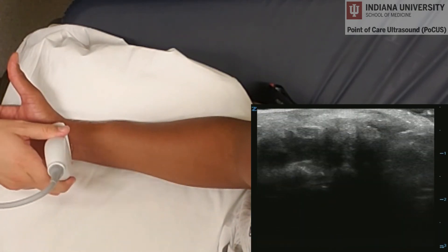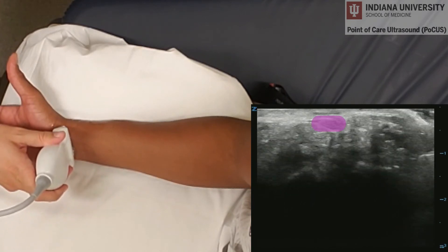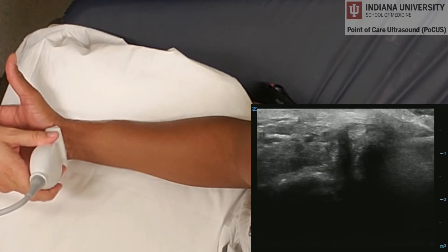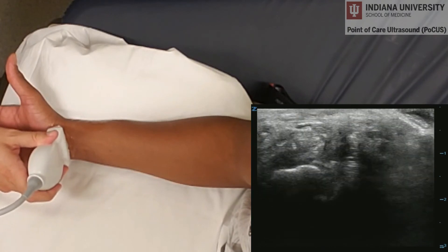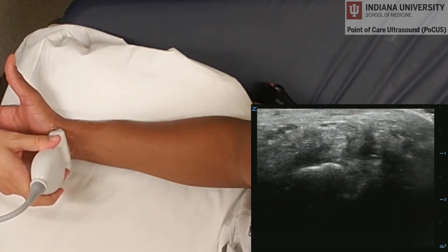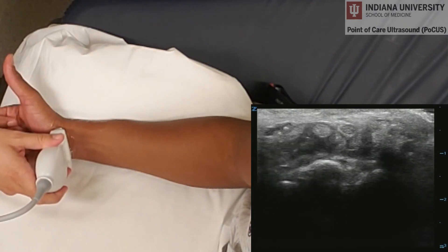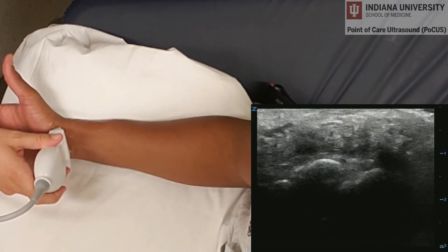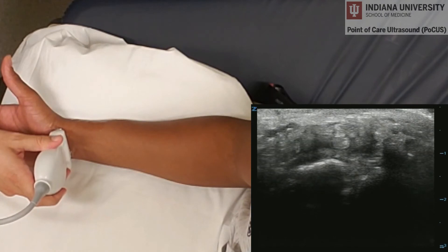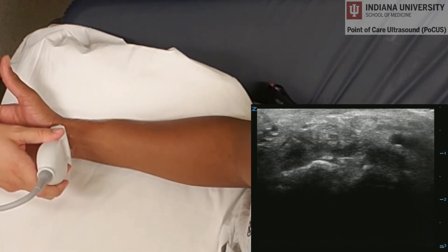First, we'll be looking for the median nerve, which is a honeycomb structure at the very top of the carpal tunnel. As we wag the probe back and forth, the tendons will become bright and dark, whereas the median nerve stays the same. And as he moves his fingers back and forth, we'll see the tendons bounce up and down, whereas the median nerve stays on the superficial side of the carpal tunnel.